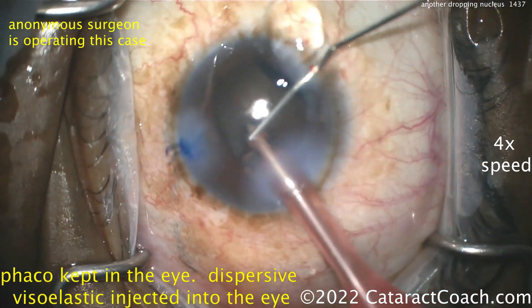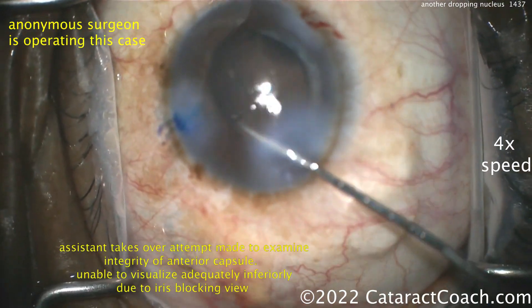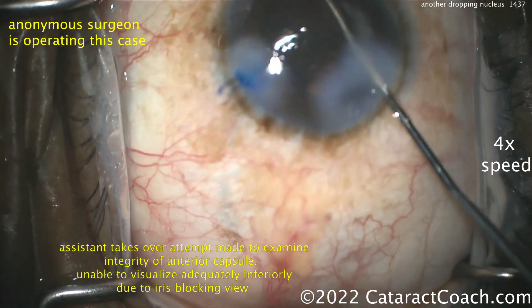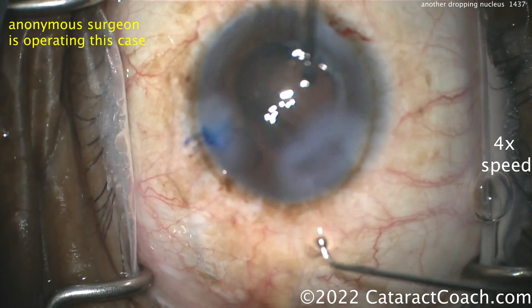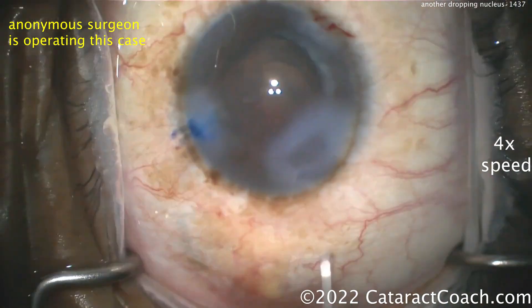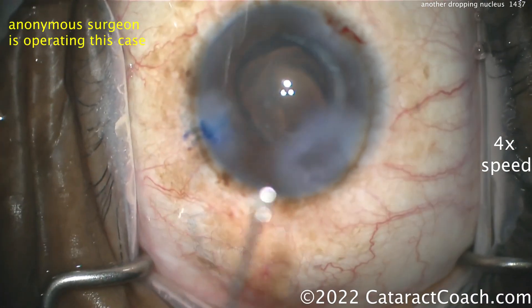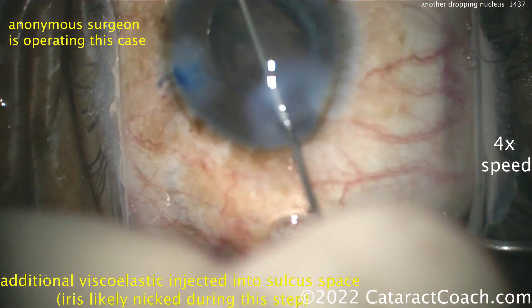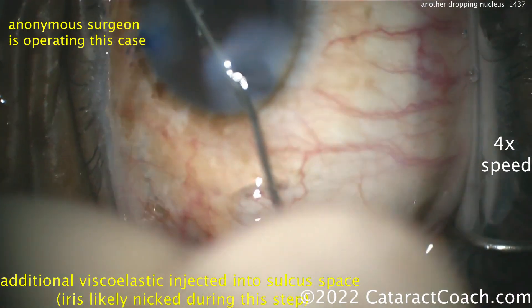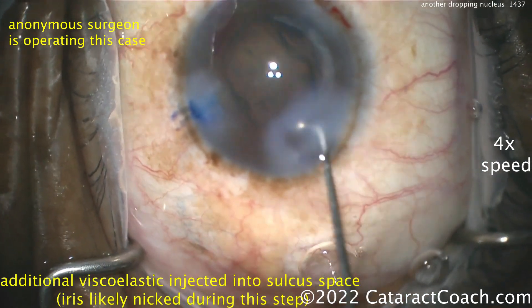Phaco probe out of the eye. I like that move — putting viscoelastic in. You can examine further if needed, but now's the time to close this up. Look at the edema around that main incision — you're going to make the retinal doctor's view a lot harder if you keep going. Let that thing go. More viscoelastic going in. It looks like there's a little bit of nicking of the iris in this step as well.